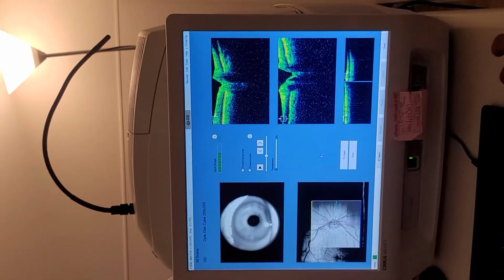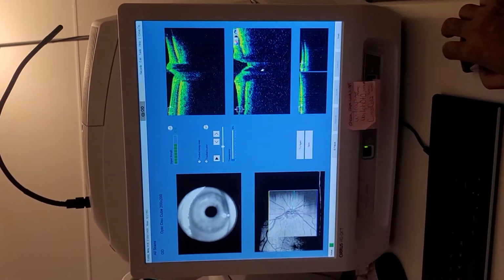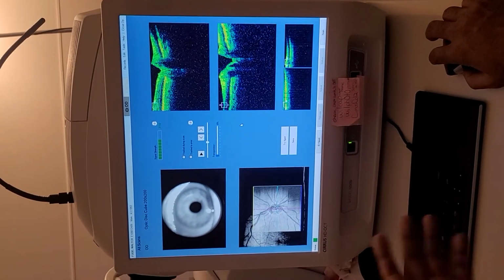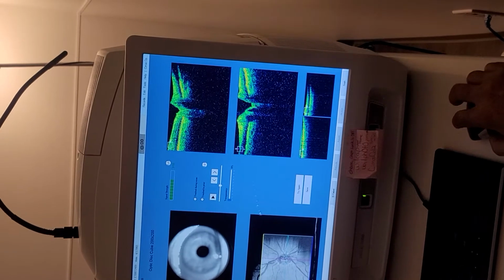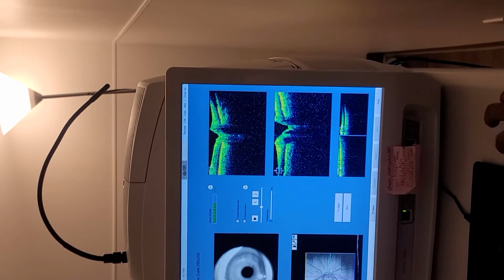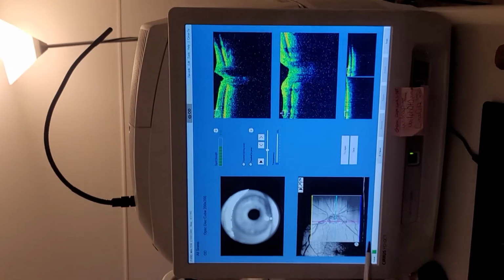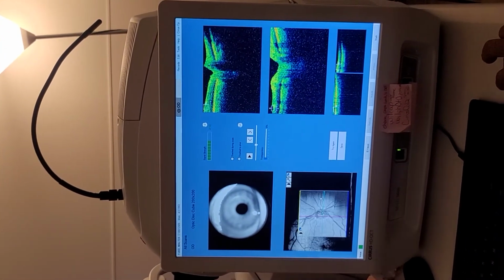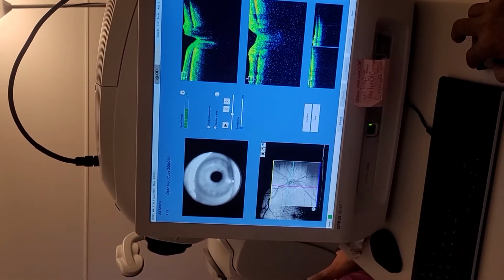Okay, you can sit back. So see how that's up? You can't change that now. Try. You cannot change that now, before you took it. But what you can change is your vertical and horizontal line, the blue and the pink, but you can't move this whole thing down. So technically, you would want to retake it.